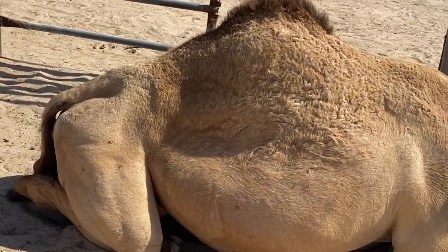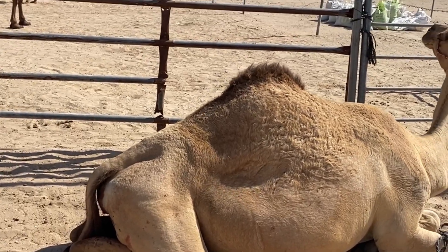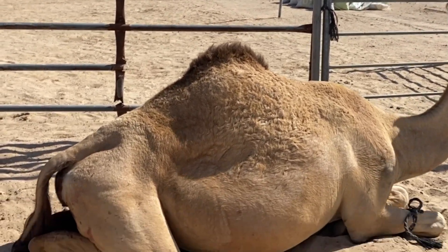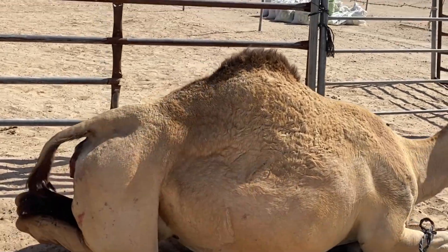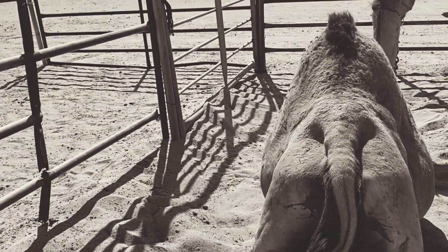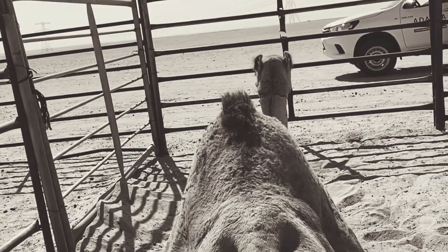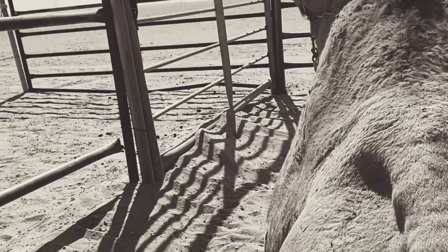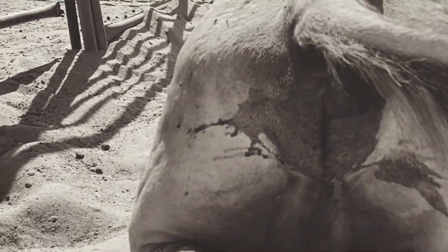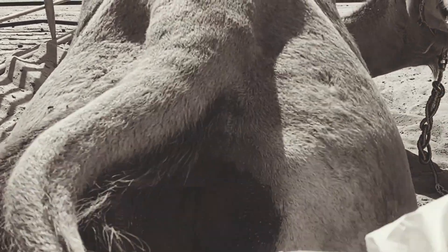Hey guys, what's up. So today's work — we already had three cases of this. We have dystocia, camel dystocia. In the morning we had two camels with the fetus in breach presentation, meaning the hind area is the one presented towards the birth canal. So this one is probably the same.